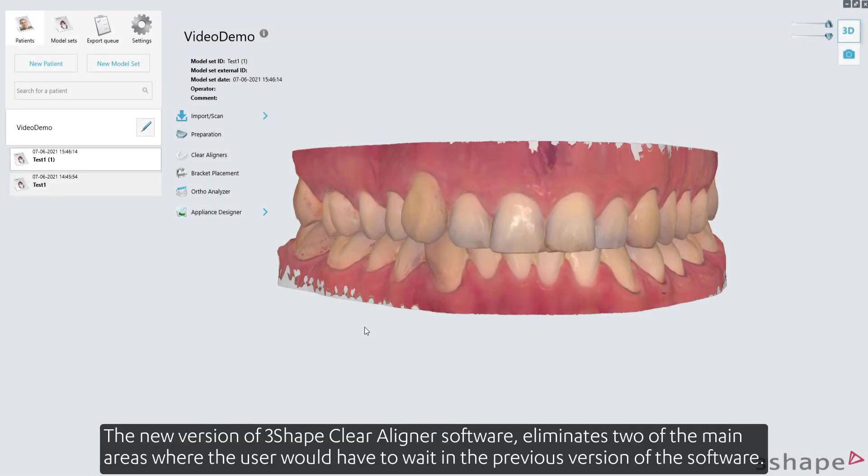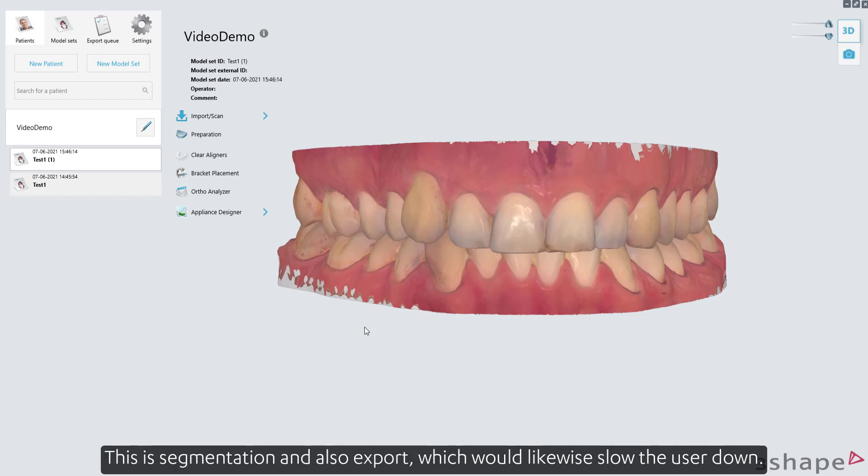The new version of 3Shape Clear Aligner software eliminates two of the main areas where the user would have to wait in previous versions of the software. This is segmentation and also export, which would likewise slow the user down.